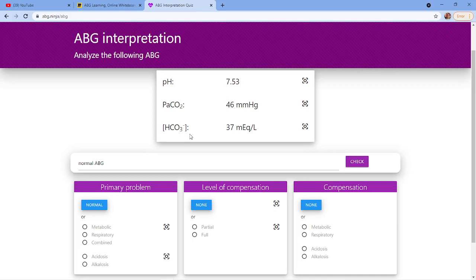And then we're going to look at the bicarb, the HCO3. Bicarb is generated by the kidneys, so that's the kidneys playing a factor in your ABG, or in your blood's chemistry. That's what we're looking at here. We're going to take a look at the little sheet here, and we're going to say, whoa, that's a lot. A lot of bicarb. And right, bicarb is basic. It's a basic bicarb, or alkalotic bicarb. For whatever reason, we have a lot of bicarb. I don't know why, but we do.